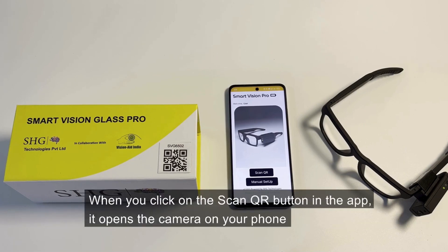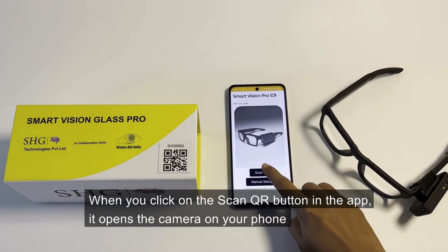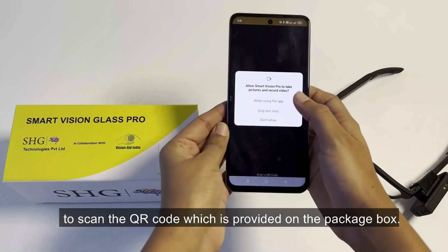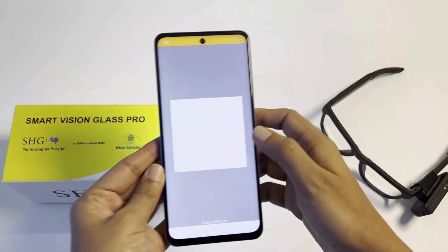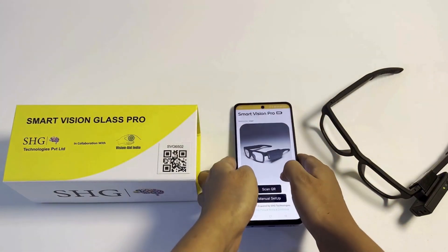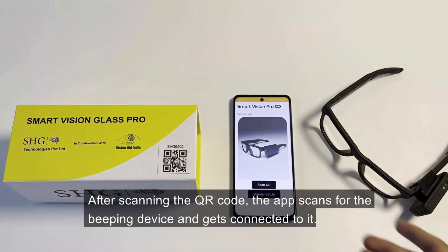When you click on the Scan QR button in the app, it opens the camera on your phone to scan the QR code which is provided on the package box. A beep sound is given to let the user know that the scanning has been successful. After scanning the QR code, the app scans for the beeping device and gets connected to it.